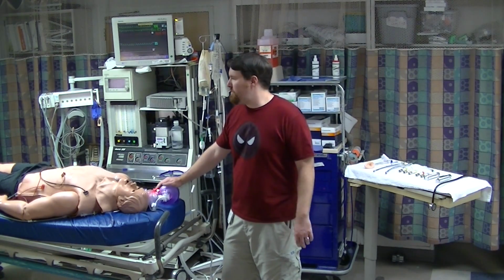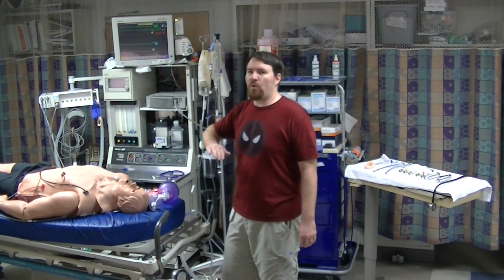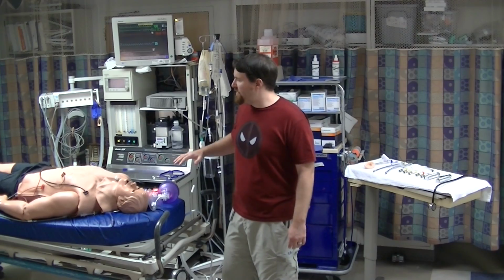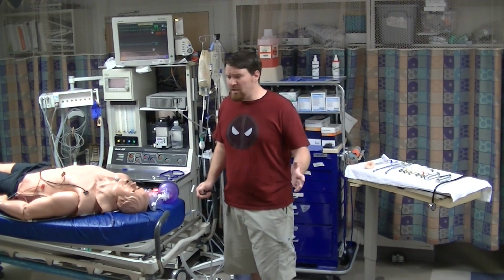The first thing you need to do is make sure that you're familiar with the resuscitation bay. Prior to ever seeing a patient, there's going to be a lot of people walking around, talking over the top of each other, doing a lot of different things. You can't be orienting yourself to your environment at the same time you're trying to critically think through the clinical skill you're about to perform on this gentleman to save his life. So you need to know where everything is.